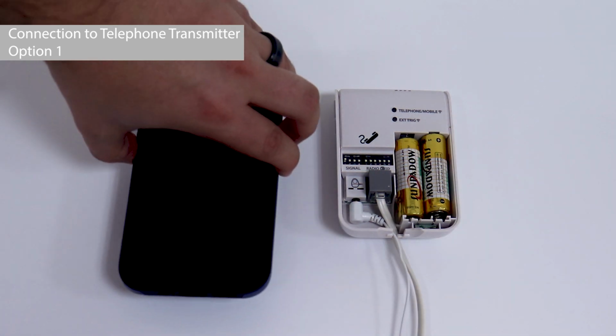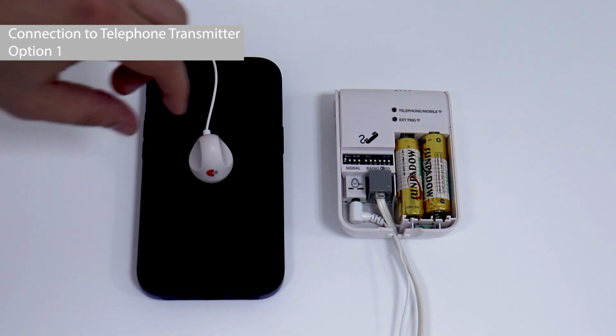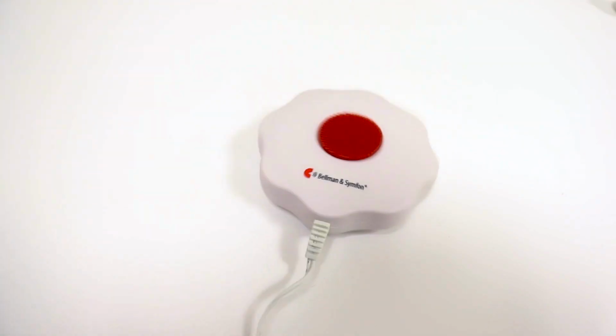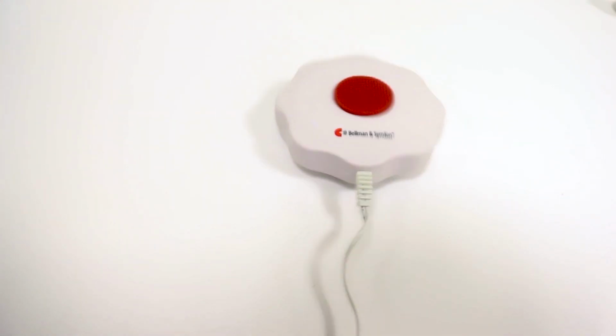Once the mobile phone sensor is connected to the telephone transmitter, place the mobile phone sensor on top of your cell phone screen. Whenever you receive an incoming call or notification on your cell phone, the telephone transmitter is activated and sending out a radio signal. Depending on your receiver, you will be notified by sounds, flashing lights, or vibrations to indicate your cell phone has received an incoming call or notification.